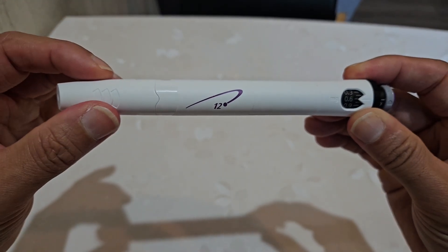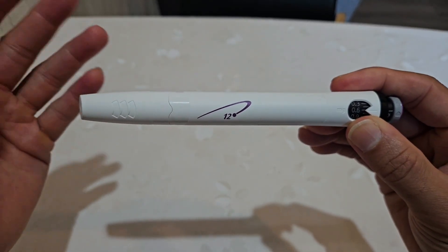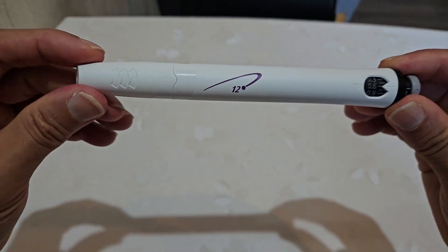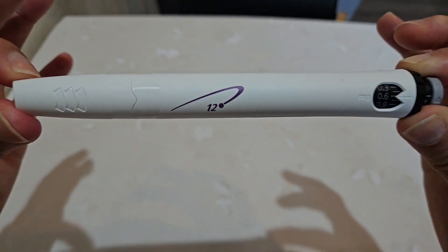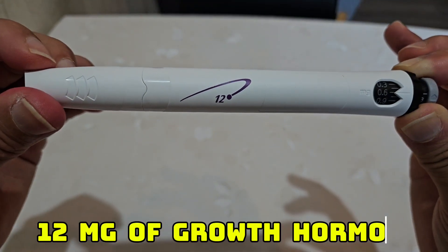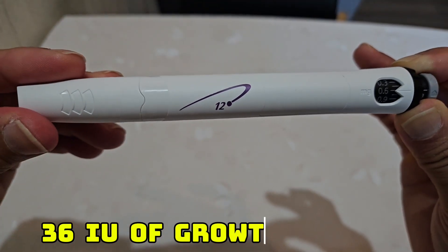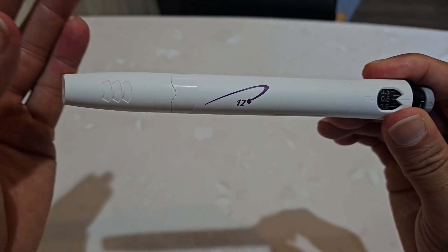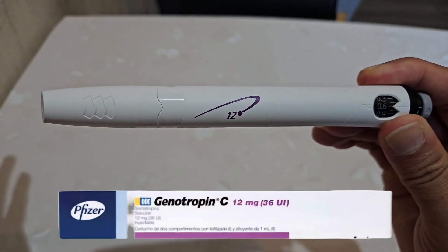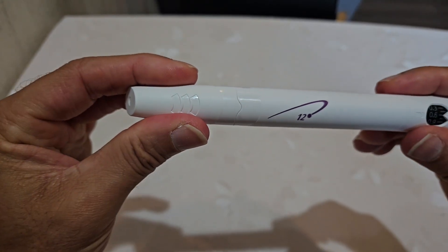By the end of the video you will perfectly be able to use your Genotropin pen. Let me start by showing you different types of packages, because depending on where you buy the pen around the world you can have certain labels or different labels, but the pen is always the same. This type of Genotropin pen always contains 12 milligrams of growth hormone in one milliliter of liquid, which will deliver 36 international units. You'll sometimes see '12mg/1mL' and other times '12mg/36 units' — but it's all the same.